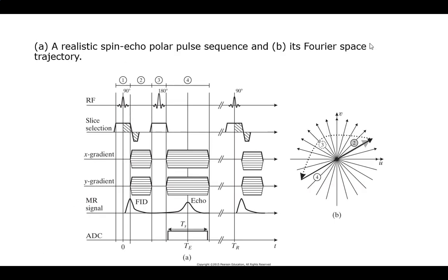Okay. So this would be an example of a polar sequence that's going in. How do I read the whole sequence? All right, so remember there are times we're going to do polar, like central slice theorem. If I want to do the equivalent of a CT reconstruction, that's in essence what we're doing with sinograms and everything else.